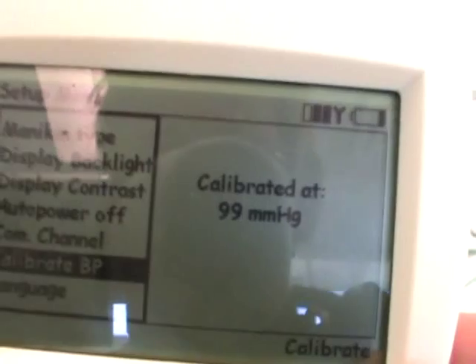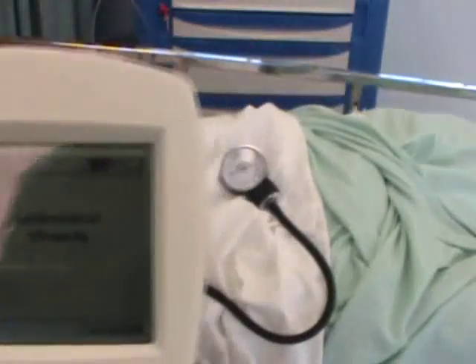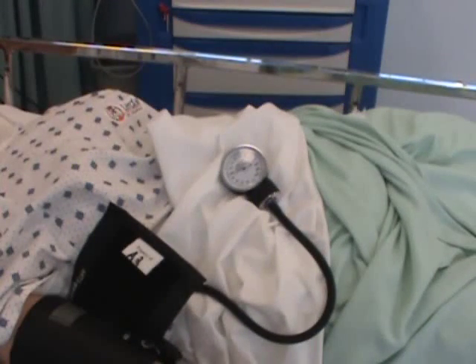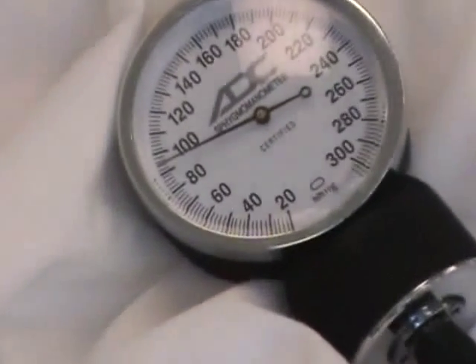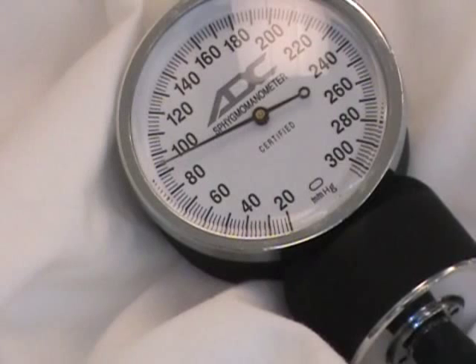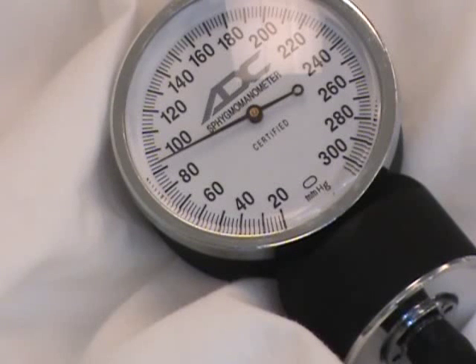What does that mean? That means that although I'm looking at the cuff thinking it was 100, I actually was a little bit down. If you look closely, you can see it's very obvious — I'm below 100. The cuff slipped a bit while we were talking. Let's try it again and see what the machine thinks.